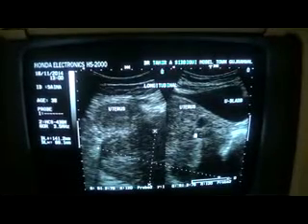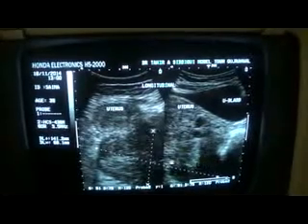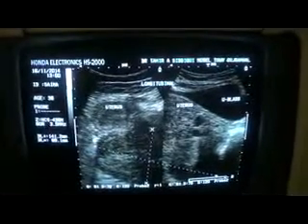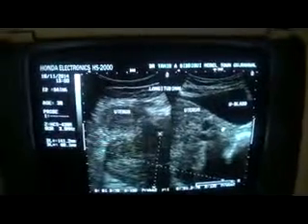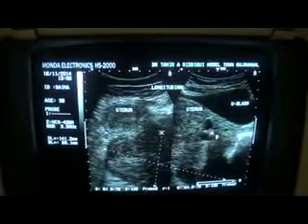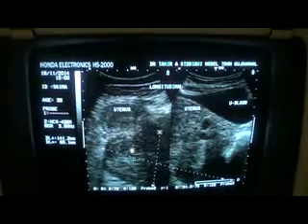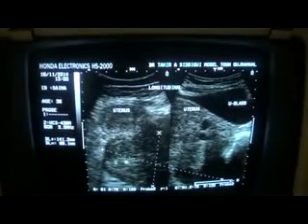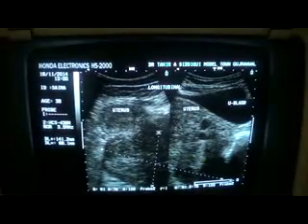Now this is the cystic area. This is the cystic area which is seen within this solid echogenic mass, which is the fibroid, a large fibroid relating to the posterior wall of the uterus, elevating the uterus anteriorly, stretching the lower segment as well as the anterior lip of the cervix, involving the posterior lip of the cervix, with areas of internal degeneration and necrosis, having mixed echo appearances, solid as well as echogenic, hypoechoic. This is an echogenic part, hypoechoic area. So this is our case of the day. Thank you very much.